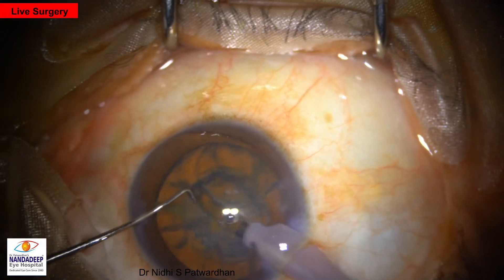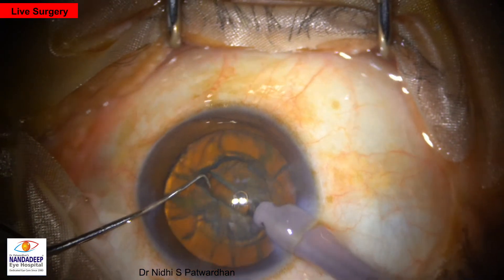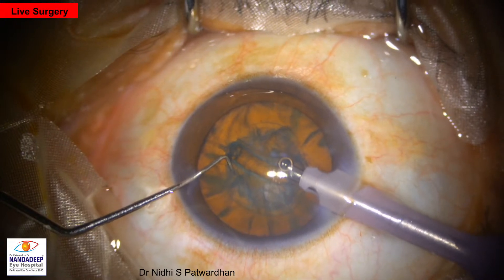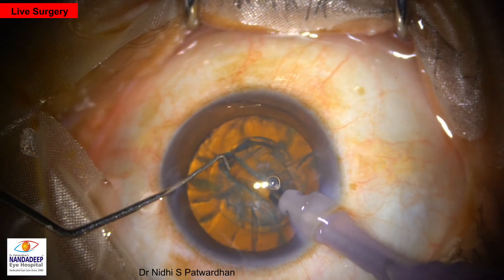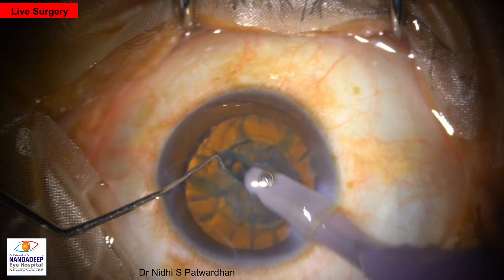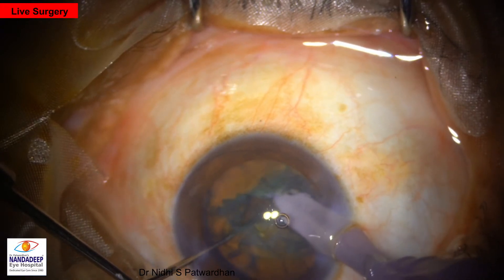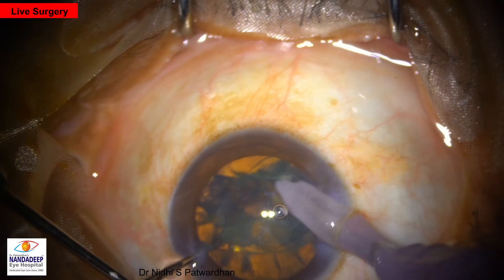The globe is kept straight and the first trench is being made. You can see that here the red glow is very good, so in such cases we have to be very careful about the depth of the trench. We should not rely only on the red glow but rather look at the depth, which is better understood when watching through the binoculars — stereopsis is better. Both instruments are at the depth and the crack is being made.